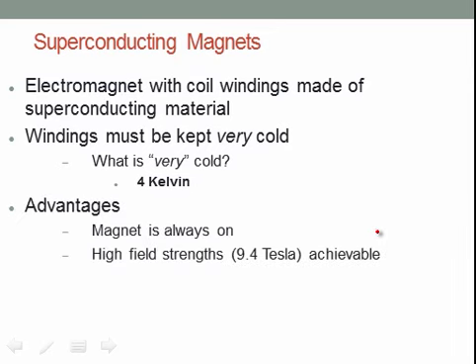So what are some of the advantages of a superconducting magnet over other magnets, such as a permanent magnet? Really there are 3 types. I haven't listed them here, but you have a permanent magnet, a resistive magnet, and superconducting magnets. Permanent magnets are always on, but you can't achieve the same high field strength because the magnet would become so physically enormous.